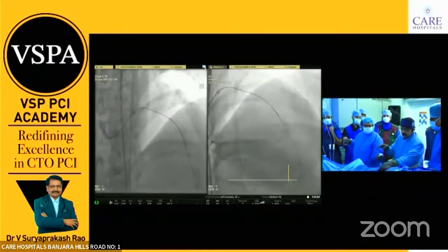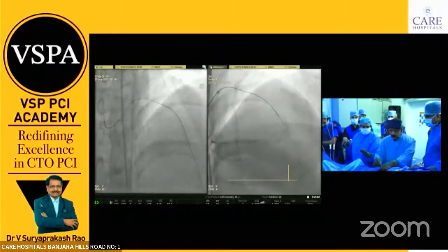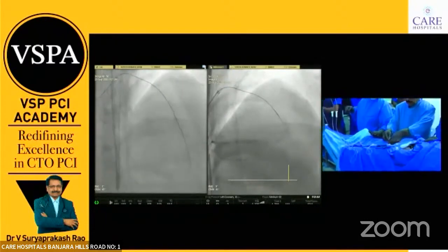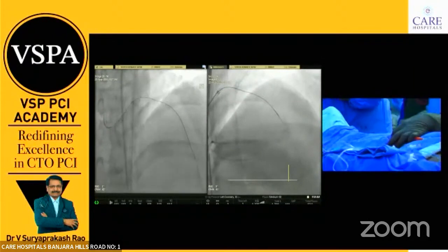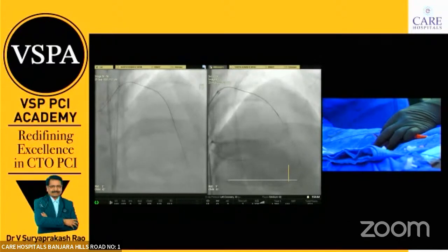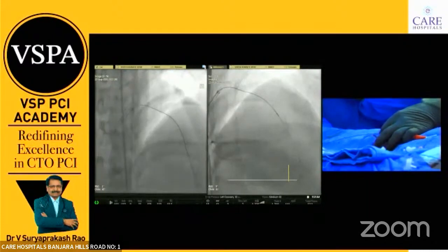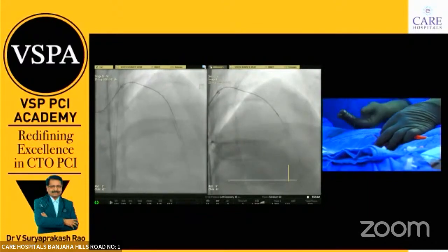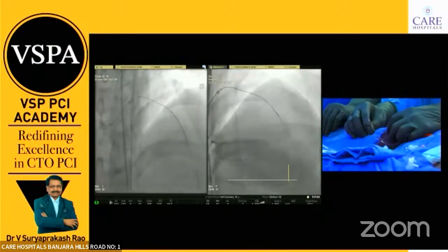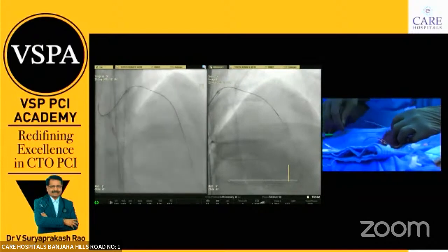Can you tell anything about the balloon? You got a mic here? That mic, you can give, he can talk about the characteristics of the balloon. If you show, I will tell. Ask him to keep the other mic here for Dr. Sudhakar so that he will tell about the characteristics of the balloon.